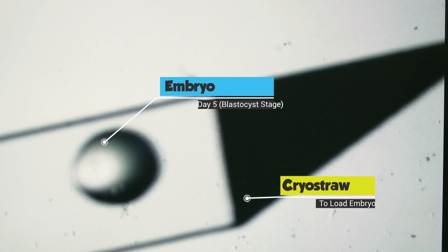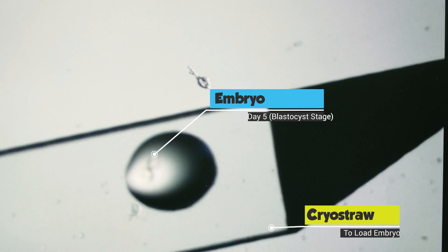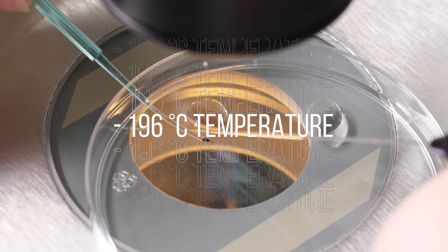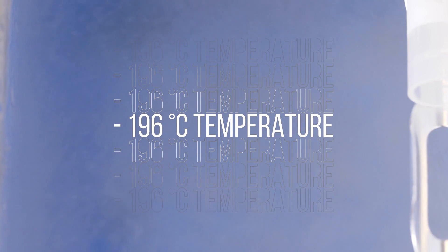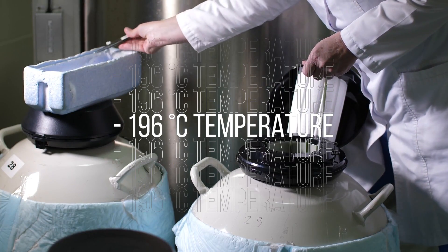You may wonder how these embryos are frozen and maintained. The embryos are frozen on specialized straws and maintained in liquid nitrogen, which has a temperature of minus 196 degrees Celsius. Did you know that embryos can be maintained over an indefinite period of time, as long as the liquid nitrogen levels are maintained in the storage tanks?